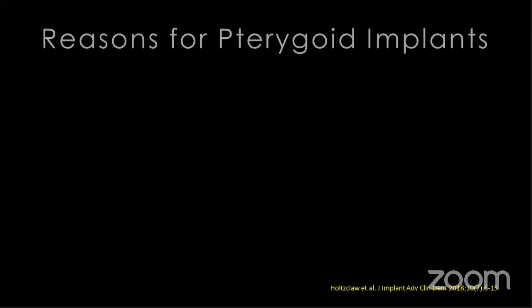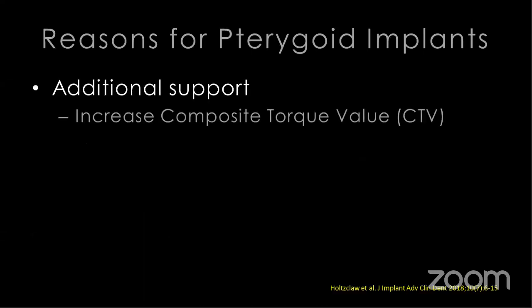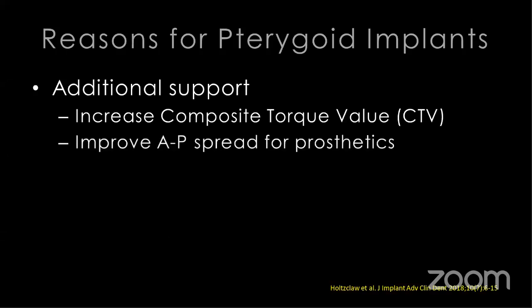Some of the reasons: we need them for additional support. They're going to increase our composite torque value, and I'll explain what that is. They're going to improve the AP spread, the anterior-posterior spread, for prosthetics.